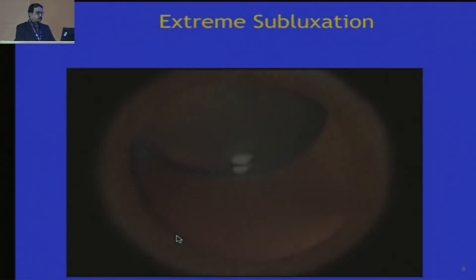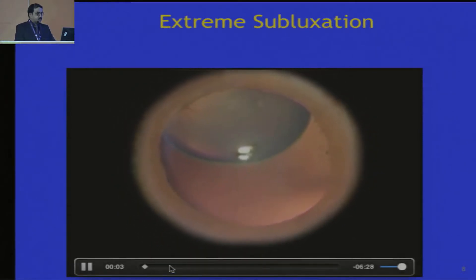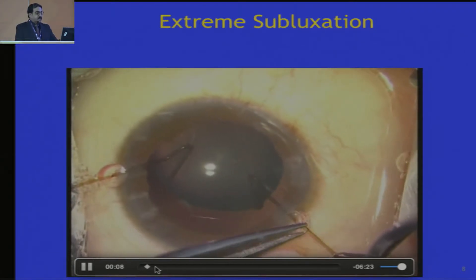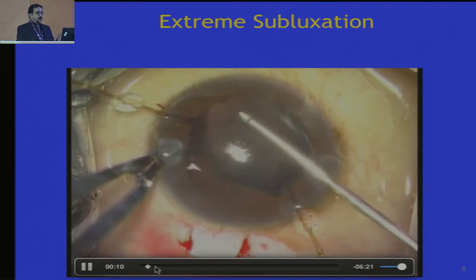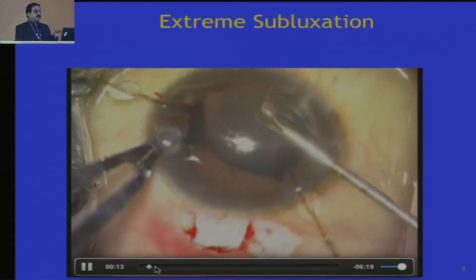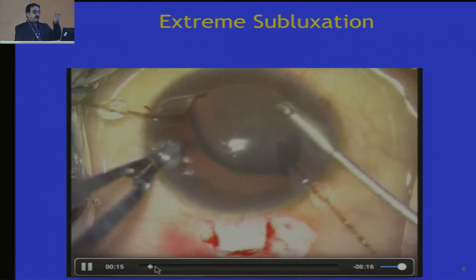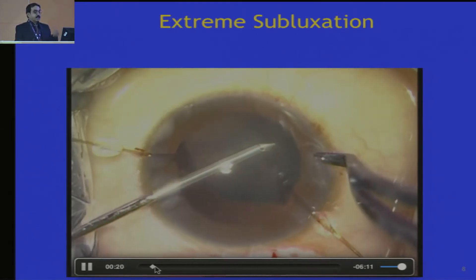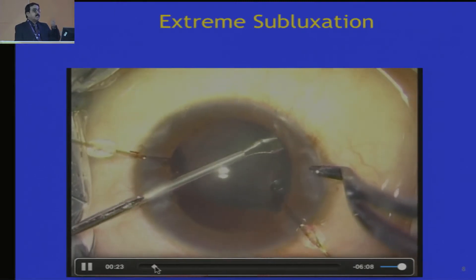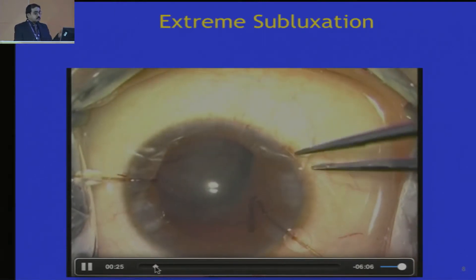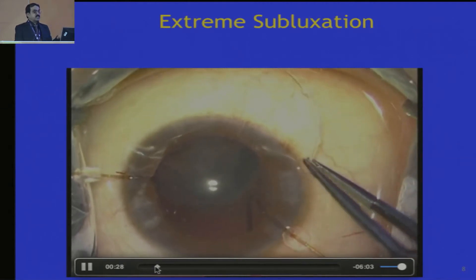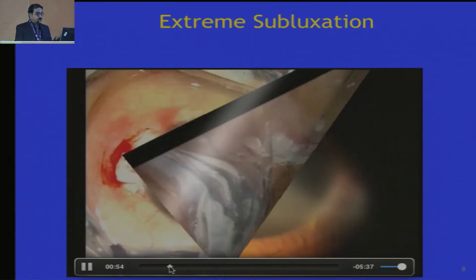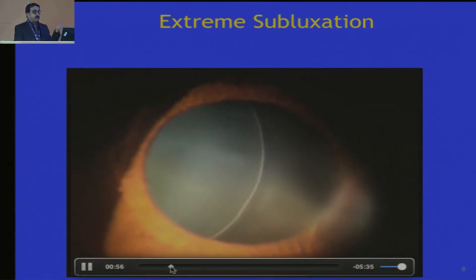Love showed excellent videos on subluxated lenses — the Marfan syndrome. I will show you my disaster in the first case. I have to show a disaster because these things do happen. I was trying to do everything right, trying to do it through the micro forceps also, but I was not able to get a good rexis. I tried to put in the CTR, could not, and in the end had to abort this procedure and go in for an SFIOL.